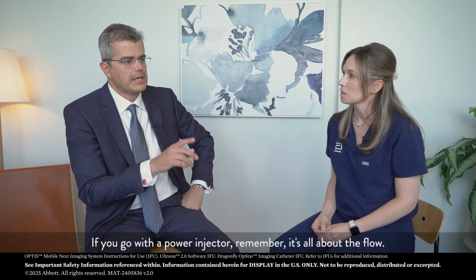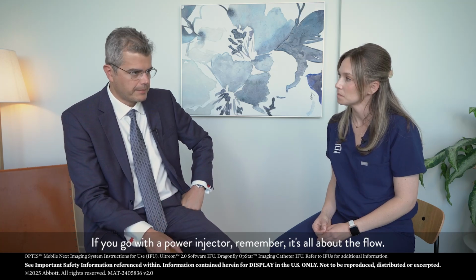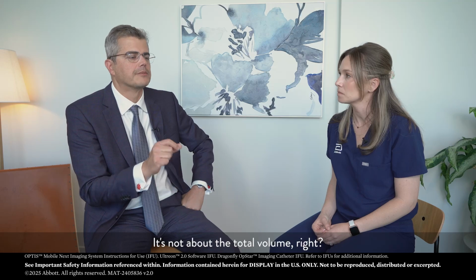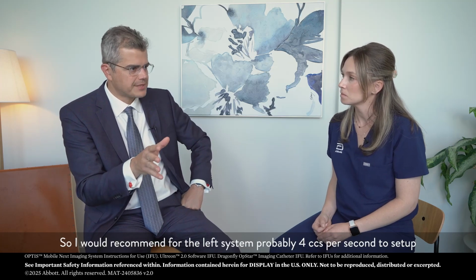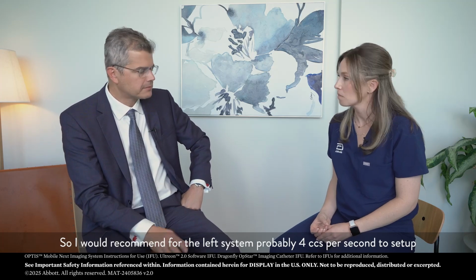setup. If you go with a power injector, remember, it's all about the flow. It's not about the total volume, right? So I would recommend for the left system, probably 4 cc's per second, the setup, and 3 cc's for the RCA.